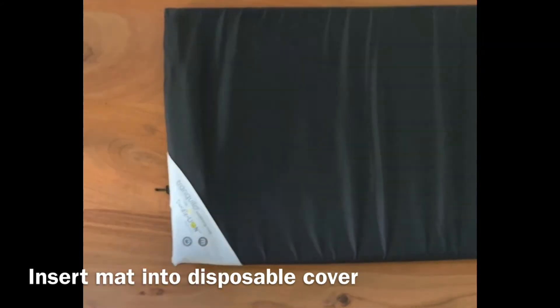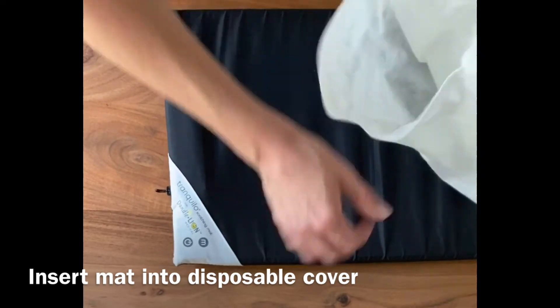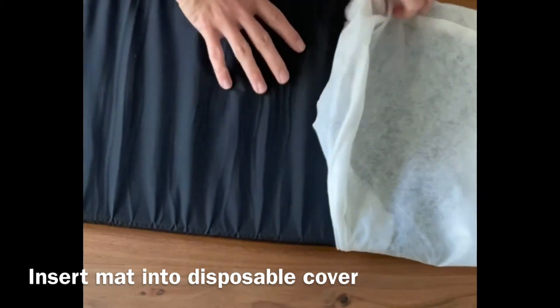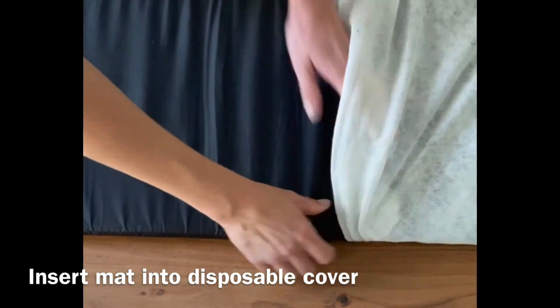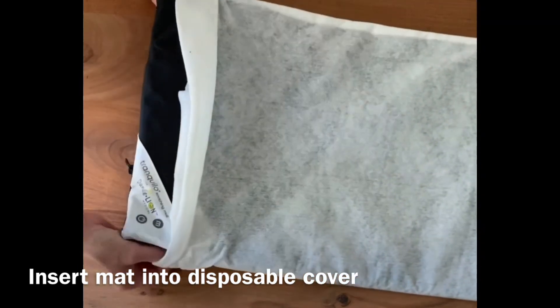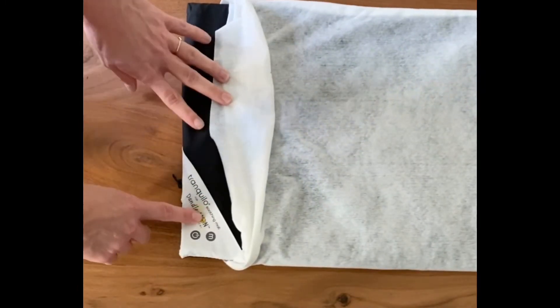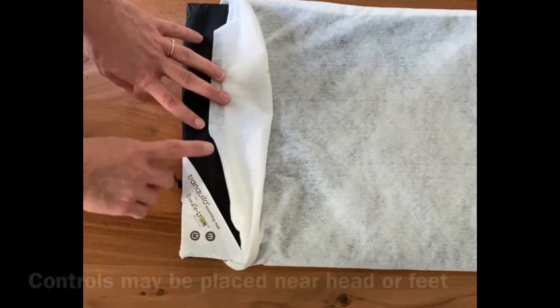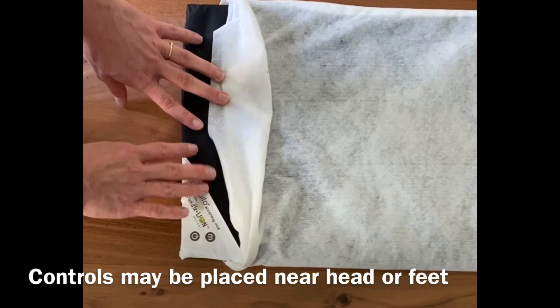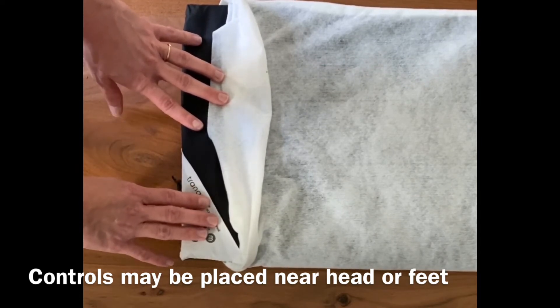Put on the disposable cover. You can see the controls for the Tranquilo vibrations are here at the end of the mat. It's okay to place these either at the baby's head or at the baby's feet. In this instance, I'm going to place the buttons at the baby's feet to make them easily accessible even while the baby is sleeping.